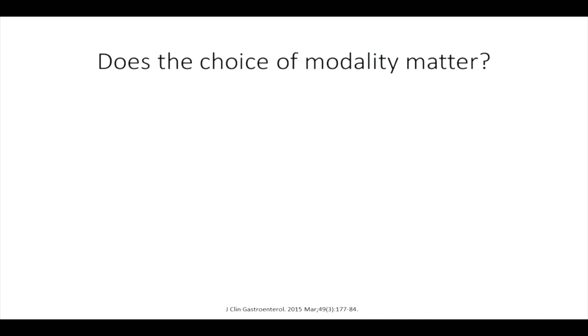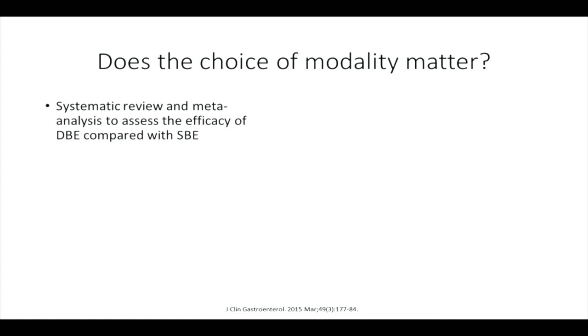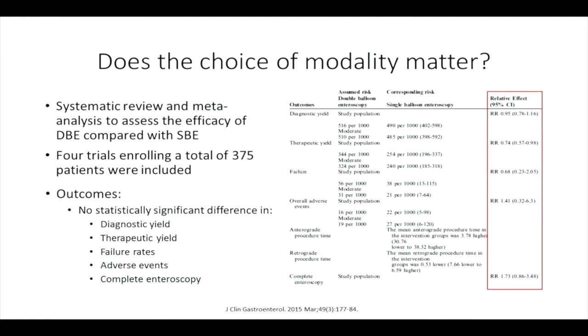Just a word about the choice of modality. There are several ways of doing deep enteroscopy, and they have been compared. This is a recent systematic review assessing the efficacy of double balloon enteroscopy compared with single balloon enteroscopy. And they included 4 trials of 375 patients. The punchline here is that there was no difference in diagnostic yield, therapeutic yield, failure rates, adverse events, or complete enteroscopy rates. So I think the bottom line here is that you have to use the technique that you're most comfortable with and that you have expertise with at your center.